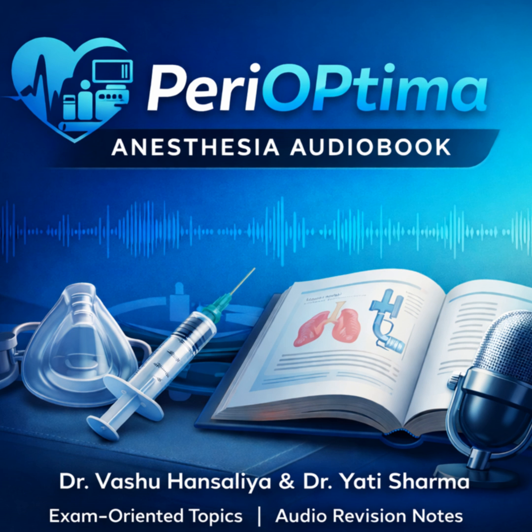That's phase 1. The balloon inflates at the dicrotic notch. What happens physically? So the heart relaxes, diastole begins, the aortic valve closes, boom, the balloon inflates. It occupies, say, 40 or 50 cc's of space in the aorta. It displaces that blood volume. Right. And since the aortic valve is closed, that blood can't go back into the ventricle, so it is forced in 2 directions. Distally to the body and, crucially, proximally into the aortic root.